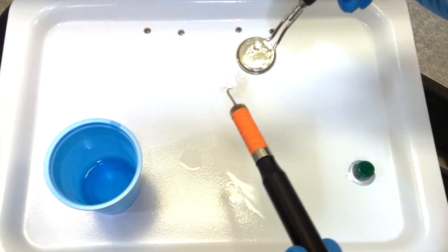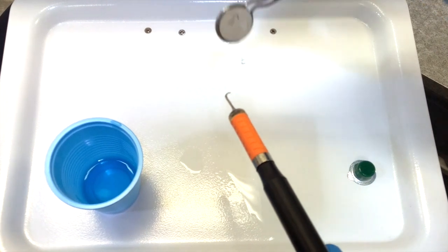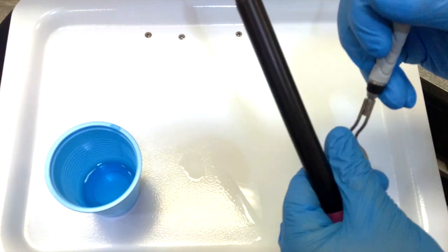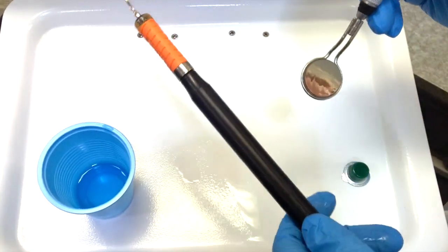It also makes it really fresh so the patient really likes the taste of the mirror. The tricky thing with this is that you really have to be re-dipping it quite regularly throughout your procedure.